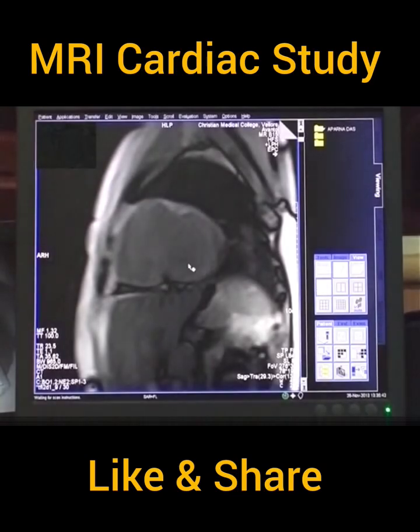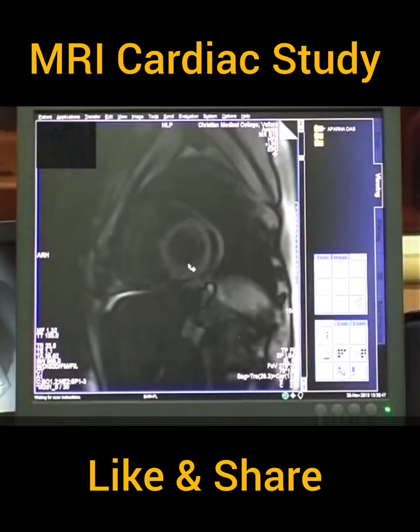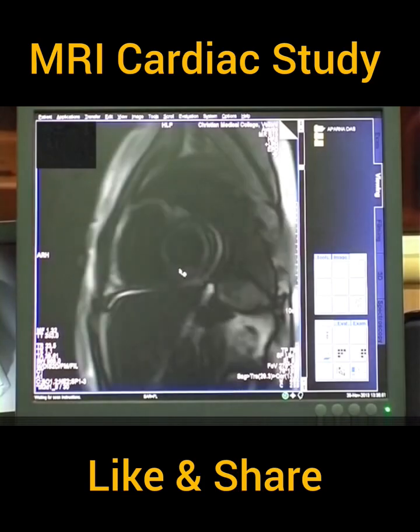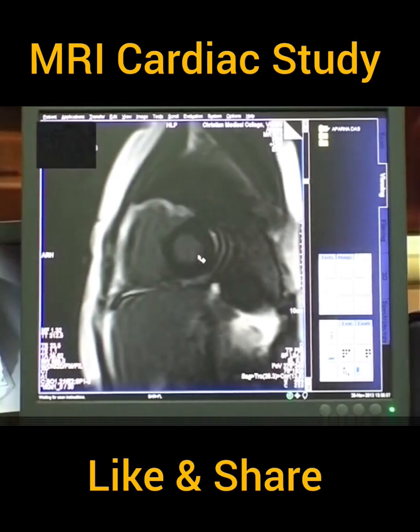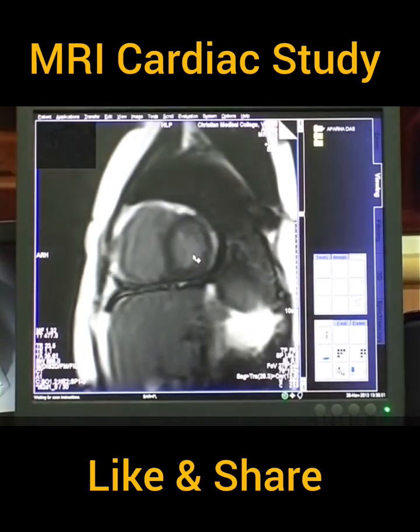Slowly, the blood turns black. And after that, the myocardium turns black. The second image after the myocardium turns black is chosen as the optimal time of inversion.